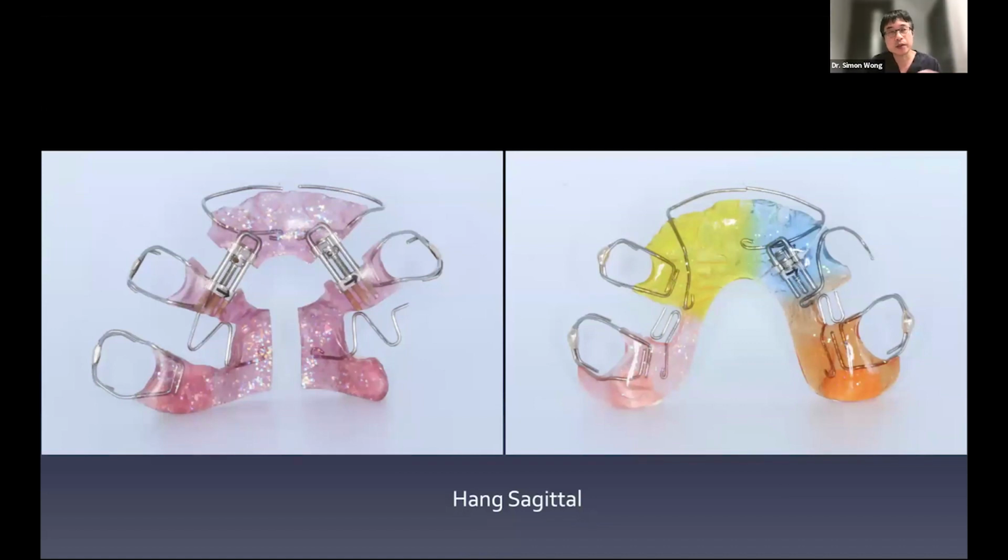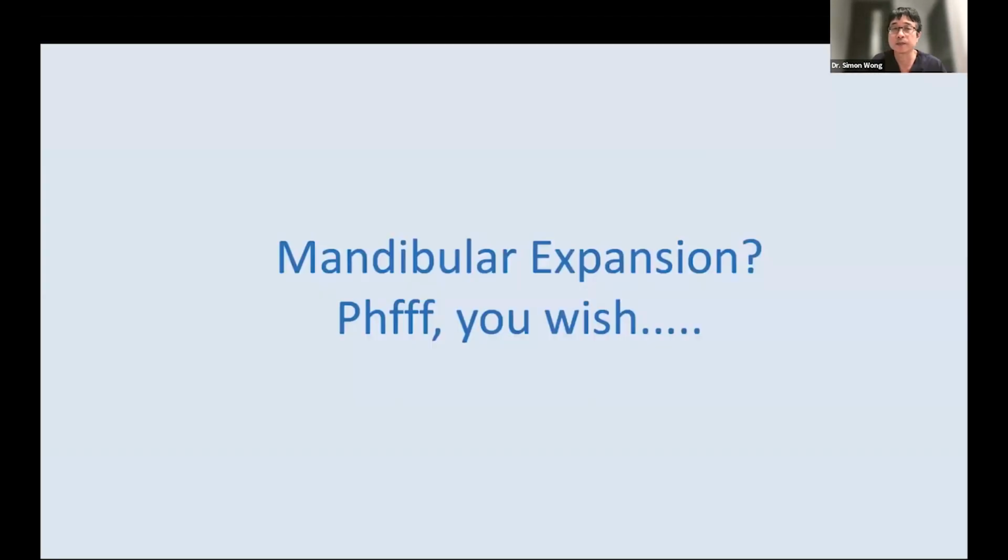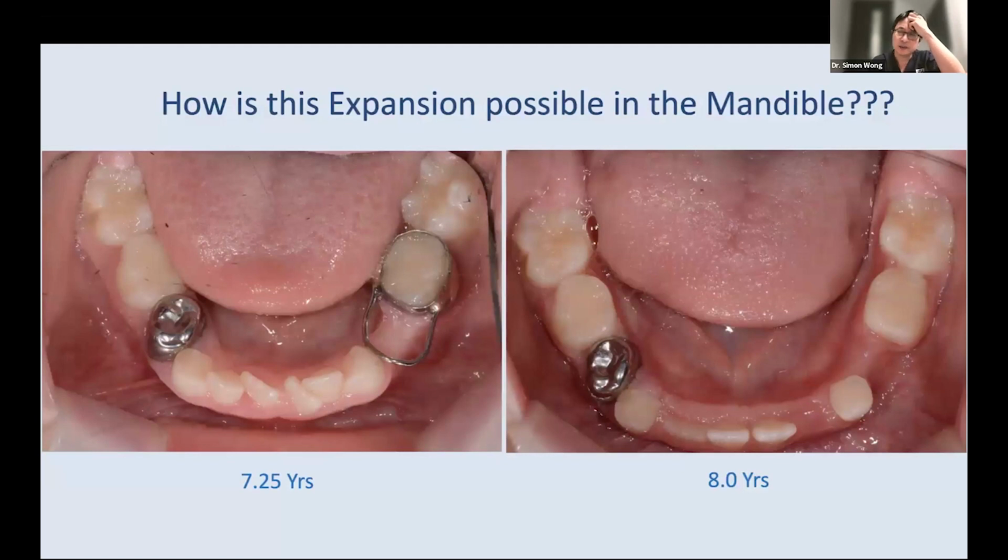We have systems that allow us to develop space in young children where historically we've had to accept the compromise of extractions. We've been able to develop arch forms in the maxilla, but interestingly, we've also been able to develop enormous changes in the mandibular arch. Now, when I trained, I was taught once the lower permanent canines come through, no further arch form development is possible in the mandible. Mandibles cannot be expanded. It's written in stone. Yet I was seeing changes that were difficult to explain when you looked at textbooks and when you looked at research.